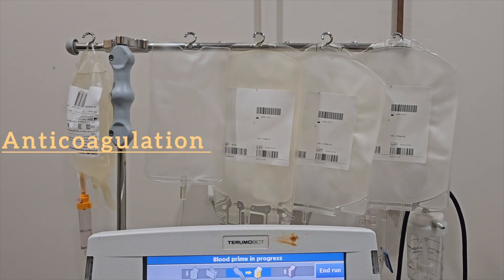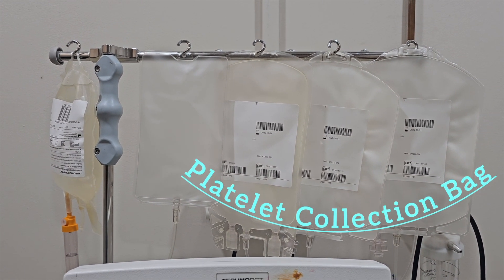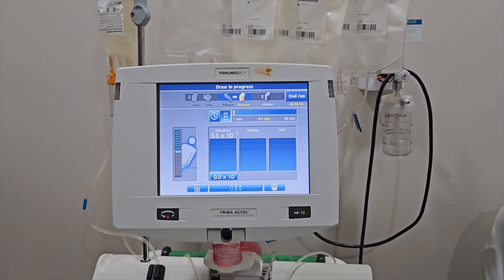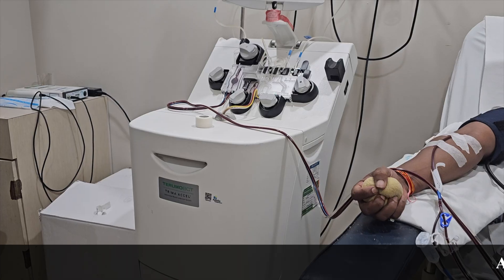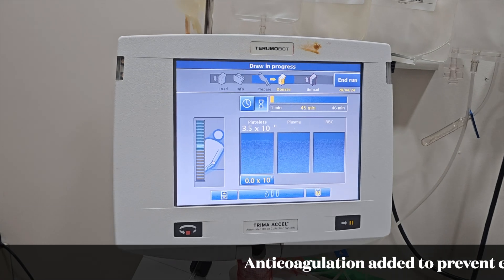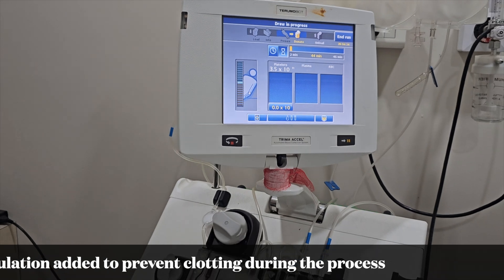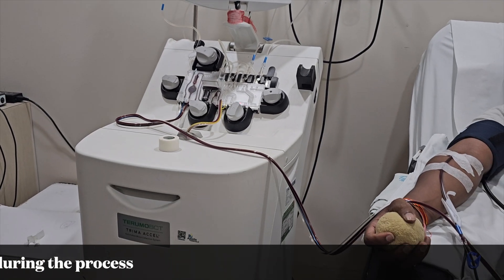Citrate-based anticoagulation is used to prevent clotting in the circuit.